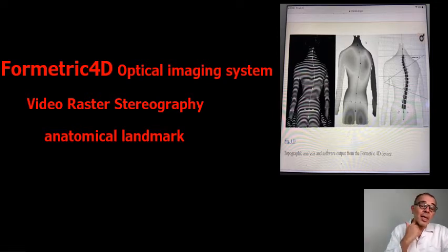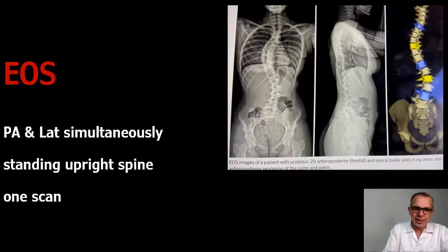Again, they use it a lot in postural studies, and also in bracing manufacturing. Because of this particular advantage, it's non-invasive, cost-effective, and easy to do in the clinic. The optical imaging system is an easy device. It has certain rules to follow just to get accurate measurements, and it's a wonderful tool for the follow-up of scoliosis treatment for any patient, lowering doses and all this nice stuff.